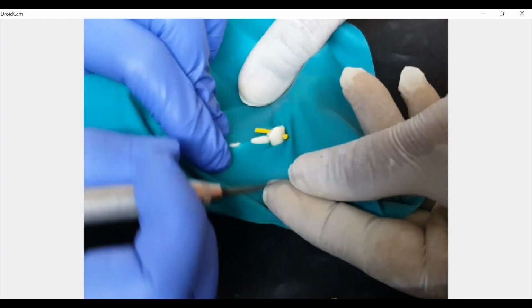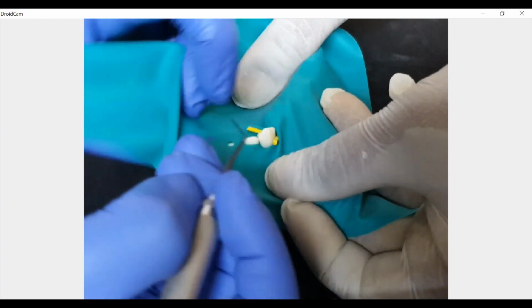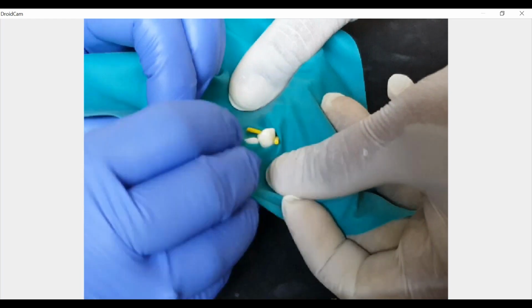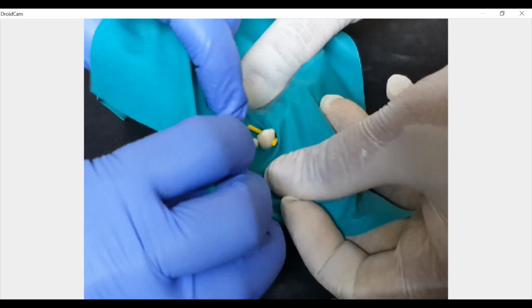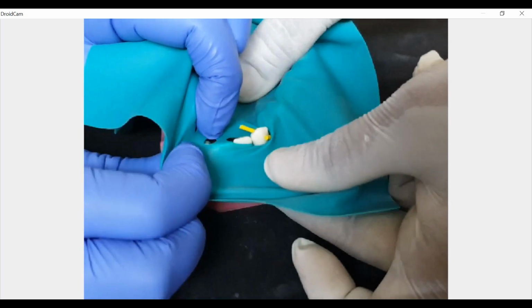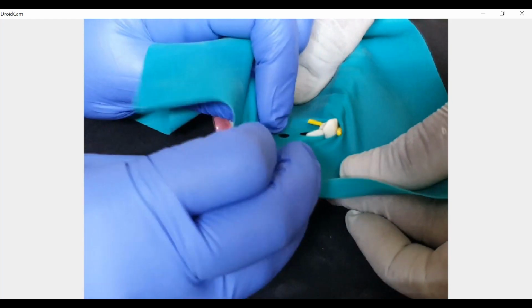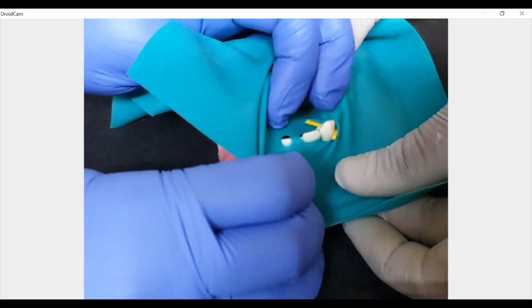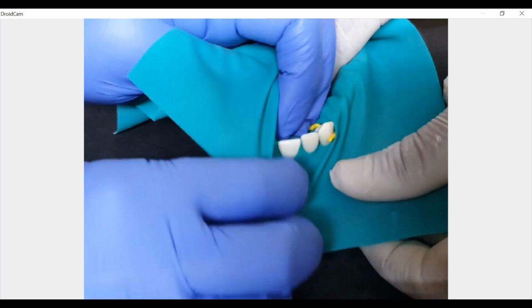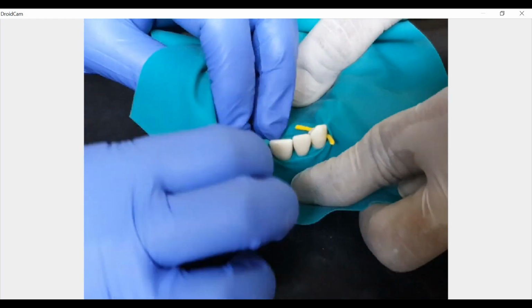So suppose, I'm trying my best to make it aesthetic. So here, this edge, you'll have to treat it like a knife edge and then engage it into the gap. I think you can't see it. Wait. Okay. So engage it into the gap, and slice it like you're using a knife to cut an apple. So it goes inside. So that is knife edged.